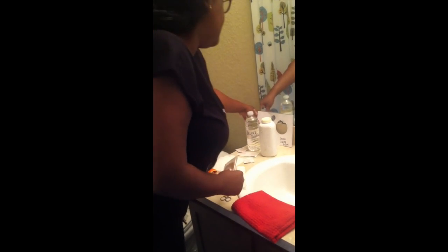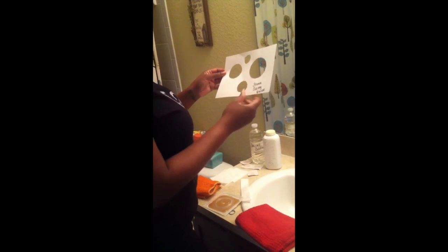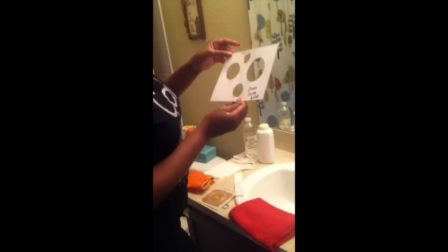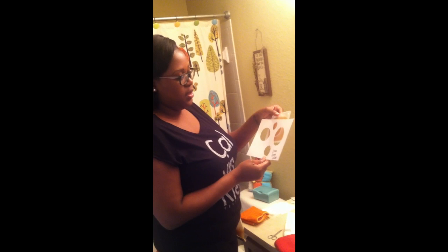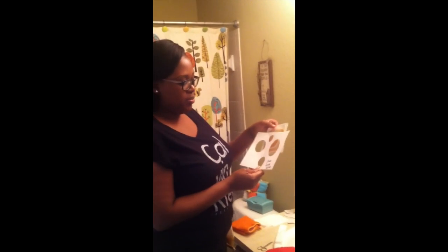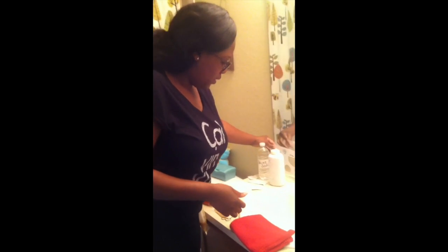I have my scissors here and of course the adhesive. And this is my stoma sizing chart. Basically what I do is I measure the size of my stoma — I put it over my stoma to measure the size. The reason why you want to do that is when you put the adhesive on you want to make sure that it's the right size because it protects it better and prevents leakage.